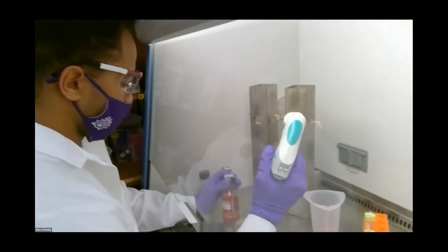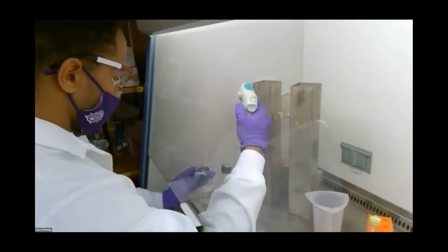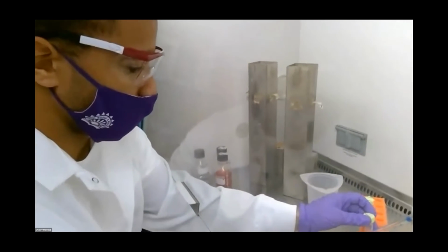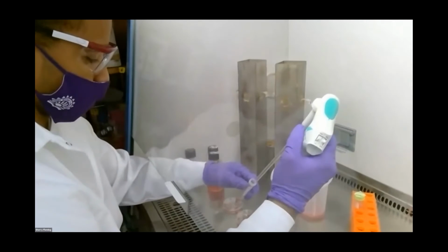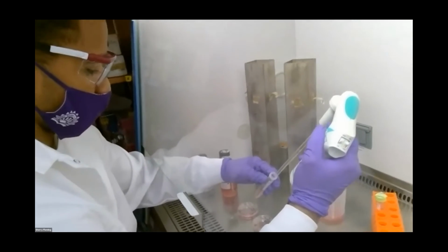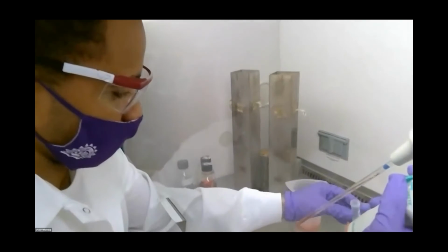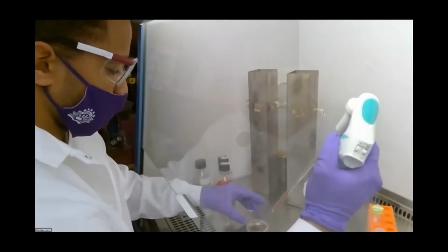So each of these pipettes, the long sticks that he's using, are sterile, and he takes them out sterilely and applies everything sterilely to the cells. Bacteria would love to grow in this media, and we're trying to prevent them from growing. But these cells that he's using are actually tumor cells. They're the same cells as what you saw under the microscope.